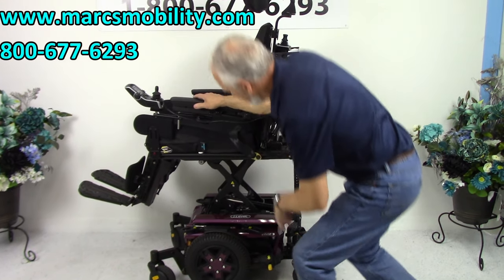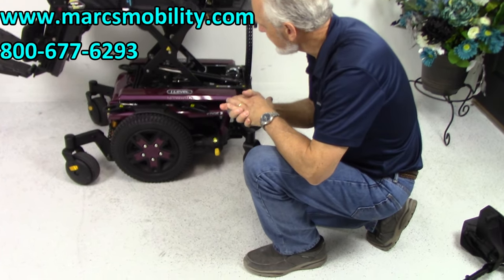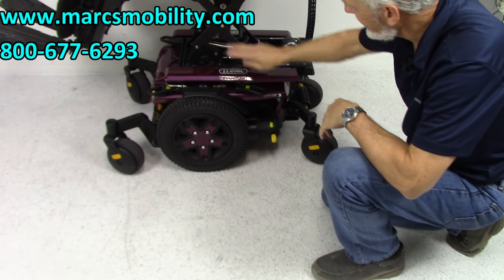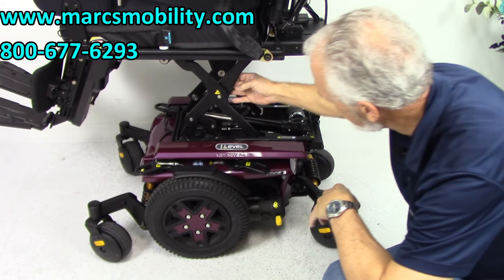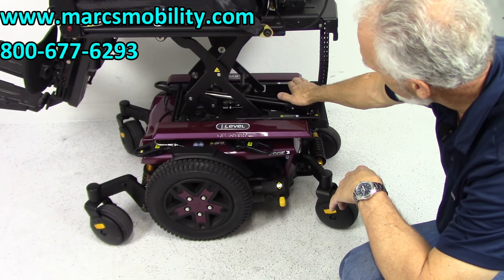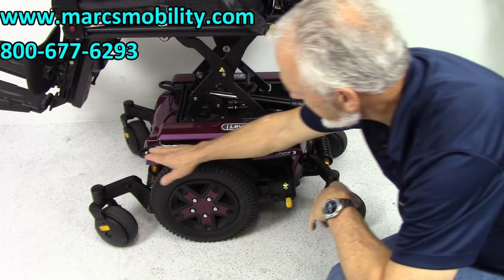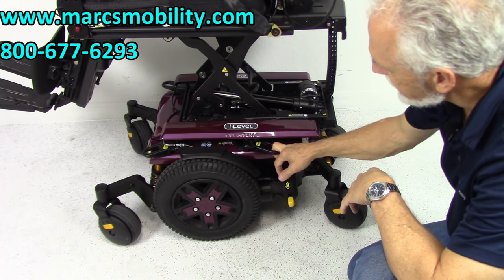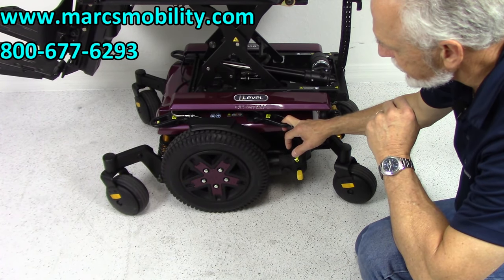Now while we have the seat elevated, let's look at the bottom. This is the Quantum Edge 3. You can see the four-point seat lift — it's like an X, two on each side. You can see the actual motor for the seat lift right here. You've got anchor points here — this is where you would tie your chair to your lift or van if you need to secure it for travel.